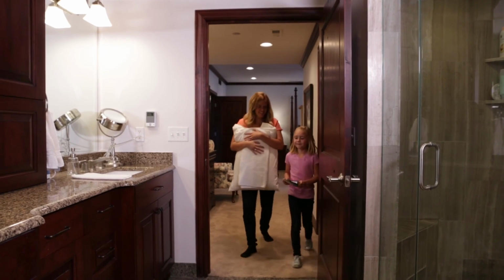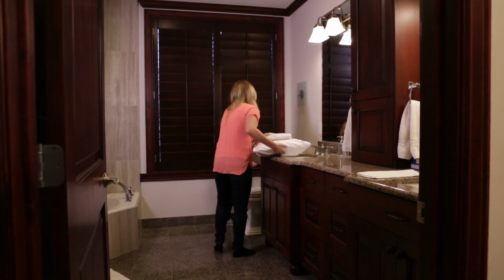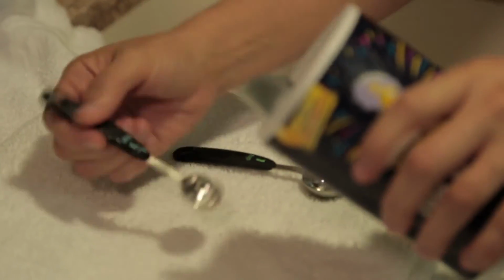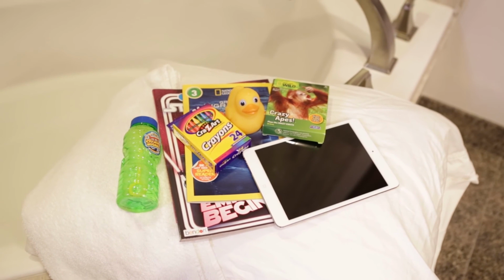Involve your child with the enema preparation. Have them play with the equipment beforehand. If they can, have them help you mix the solutions and let them pick out the distraction material for that day. You will become more confident with each enema.